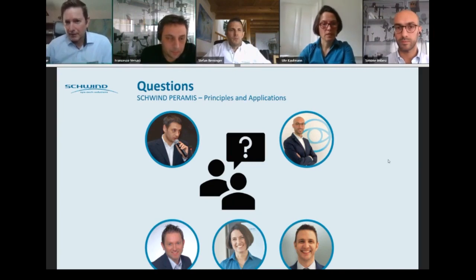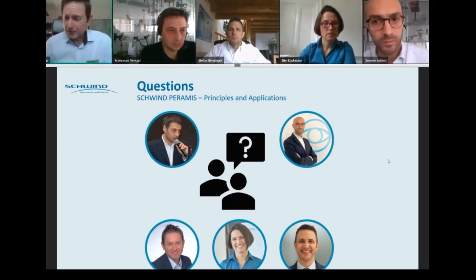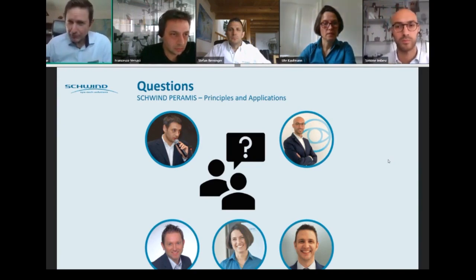Great, thank you. I have actually one question regarding accommodation. Which stimulus would you recommend to use? The square one or the slope one? Okay, this depends on what you want to test.